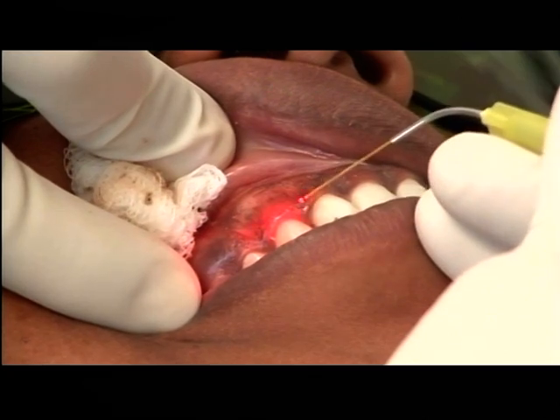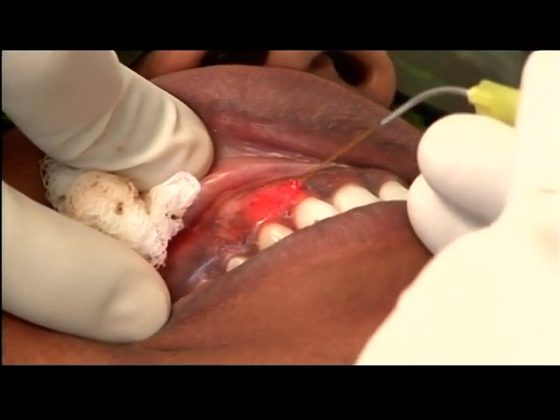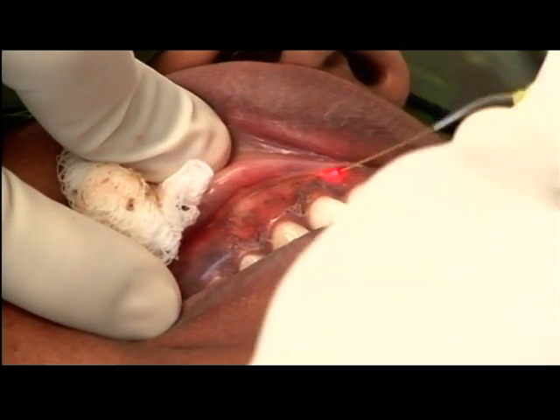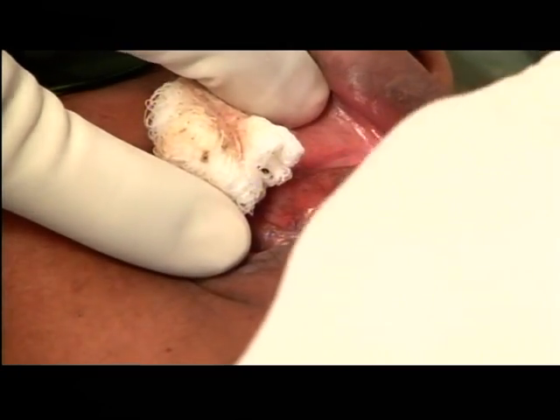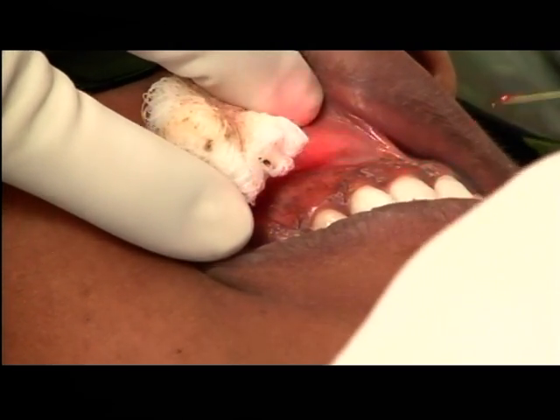Sometimes a little darkish area that you see here — one tends to go deeper. I specifically mentioned: don't worry about that, because we have already removed the epithelium. Automatically, when the healing takes place, the fresh epithelium will be minus the pigment.